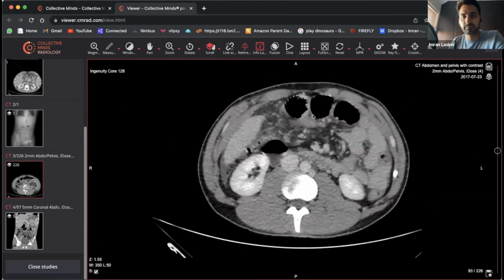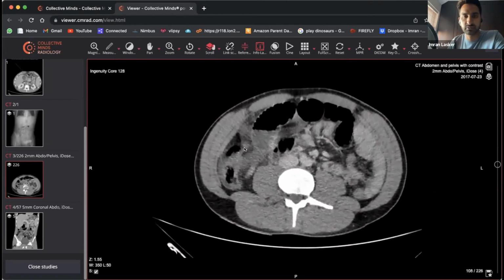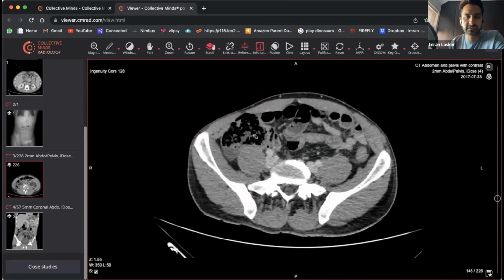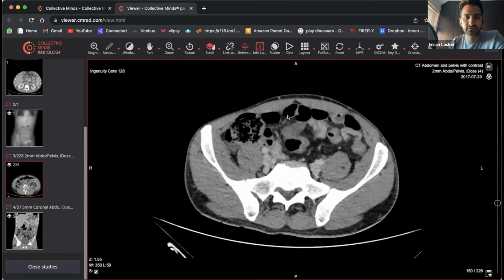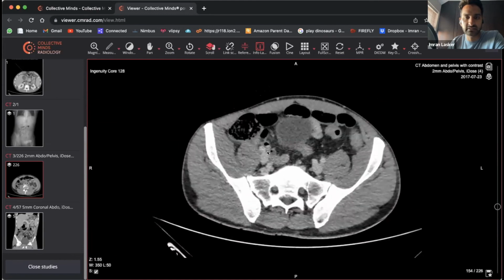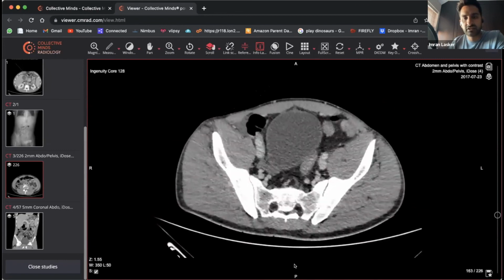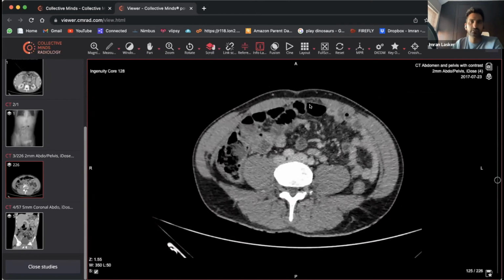Oh, we're looking like we're going behind some slightly dilated bowel. Can you see that slightly dilated small bowel? And we're creeping around the back and then going down the side, and we're coming up to the cecal pole. I don't know if anyone can see that, but I do wonder whether the appendix is just sitting somewhere within that region there. But anyway, the large bowel looks okay. Doesn't look like there's any problems there, but you've still got a lot of air sitting within the upper abdomen.